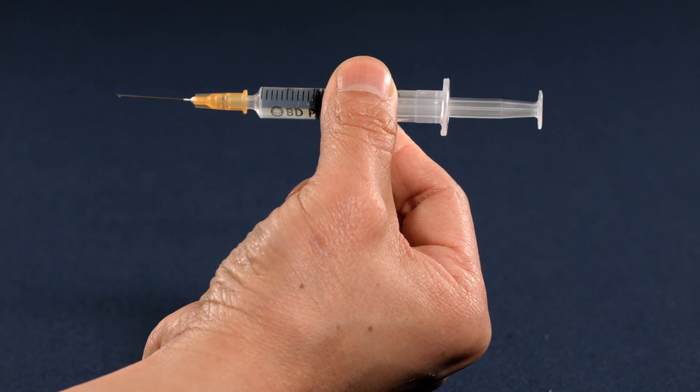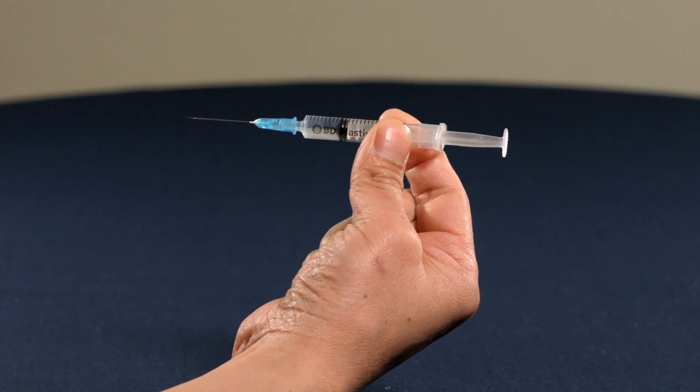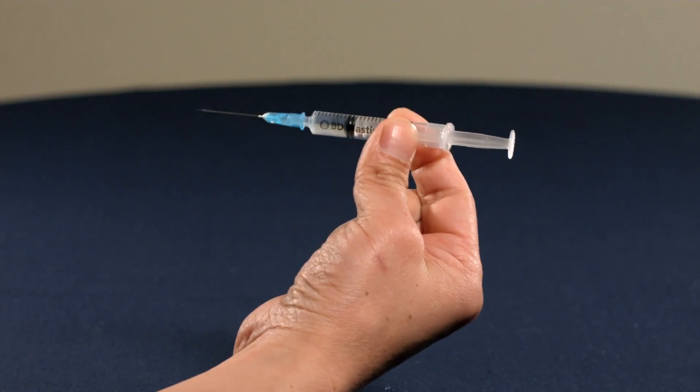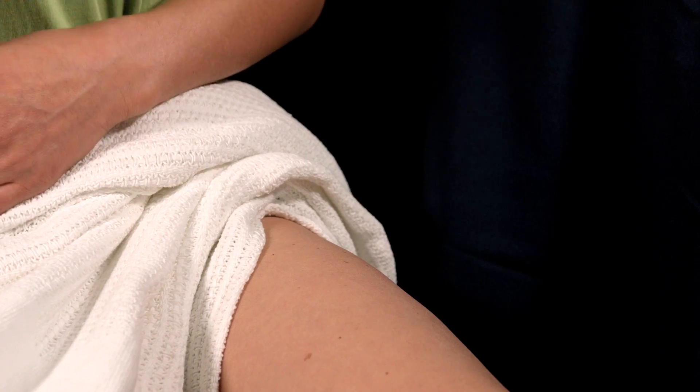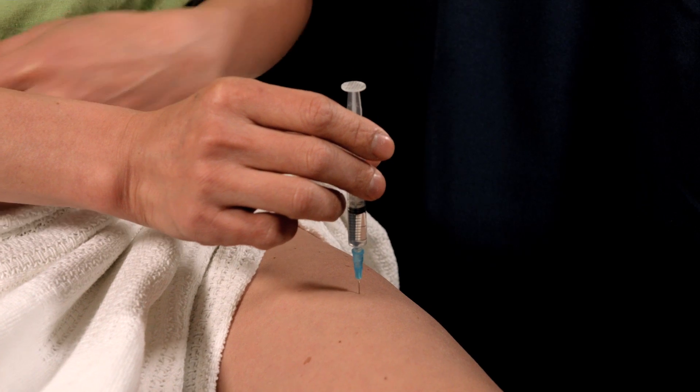If you have an orange needle, it's best to inject into the upper arm muscle. If you have a blue or green needle, you should inject into the middle third of the outer thigh. Hold the syringe like a dart and insert the needle firmly into the injection site at an angle of 90 degrees.